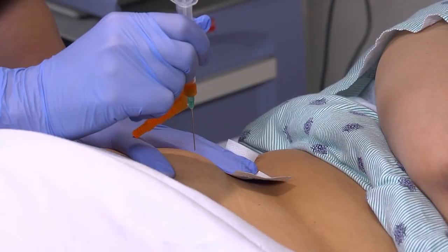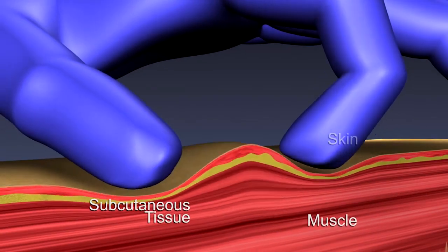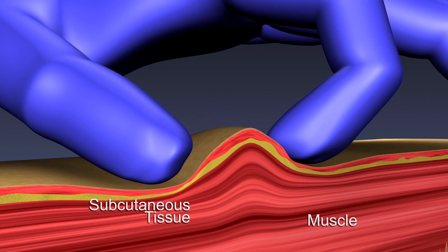Hold the syringe with the thumb and forefinger of your dominant hand as if it were a dart. Remind your patient to try and relax. Place the ulnar side of your non-dominant hand just below the injection site and pull the patient's skin laterally about 1 to 1.5 inches or 2.5 to 3.5 centimeters. Hold this position until you've inserted the needle. If the patient has little muscle mass, grasp the body of the muscle between your thumb and forefinger.